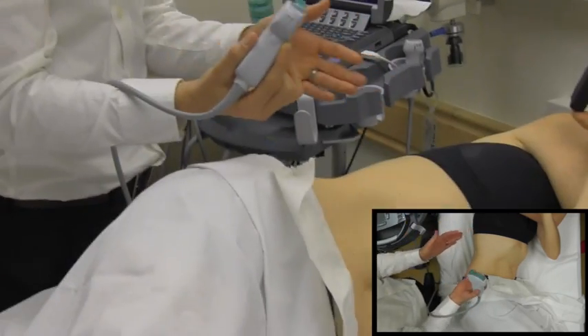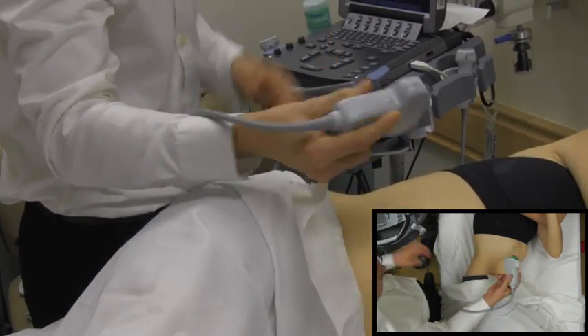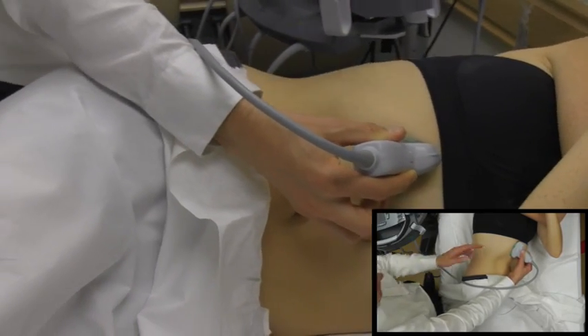You can do this with a patient supine, but you're going to get a better picture if you roll them to their left side, as the gallbladder just kind of falls out from underneath the liver when you do it that way. You're going to want to start with the probe up and down in the sagittal plane with the probe marker toward the patient's head.